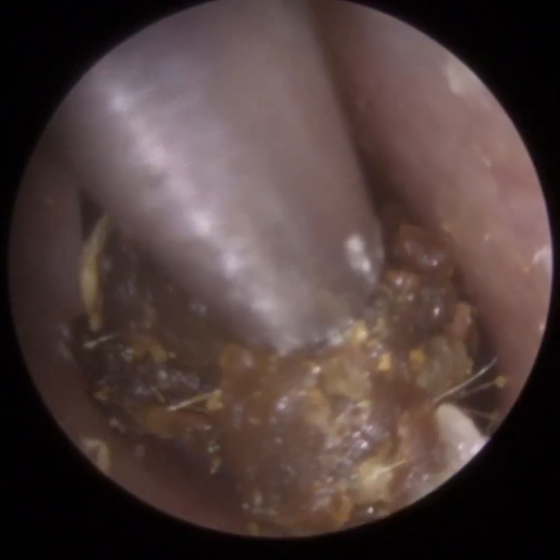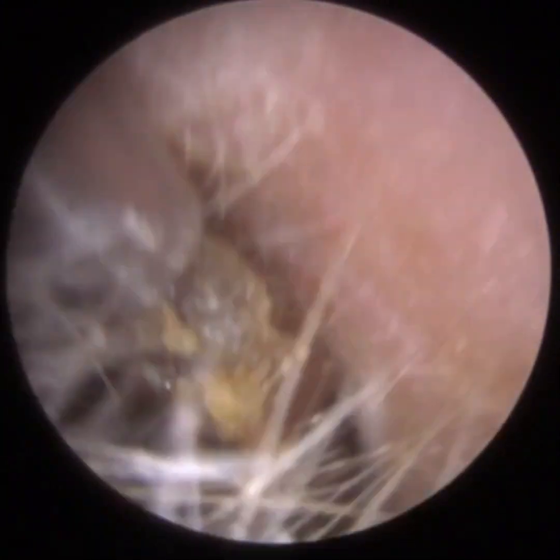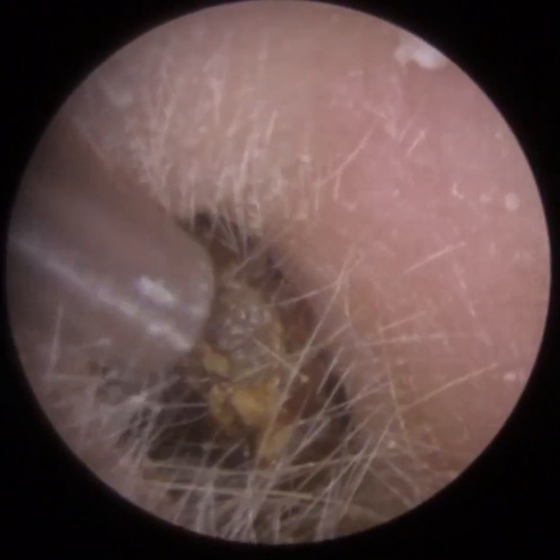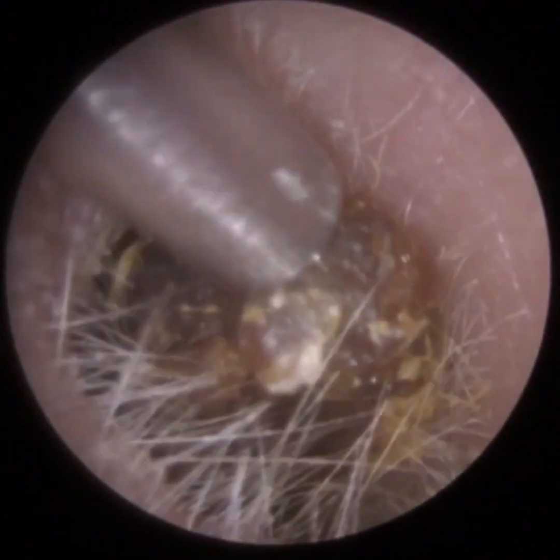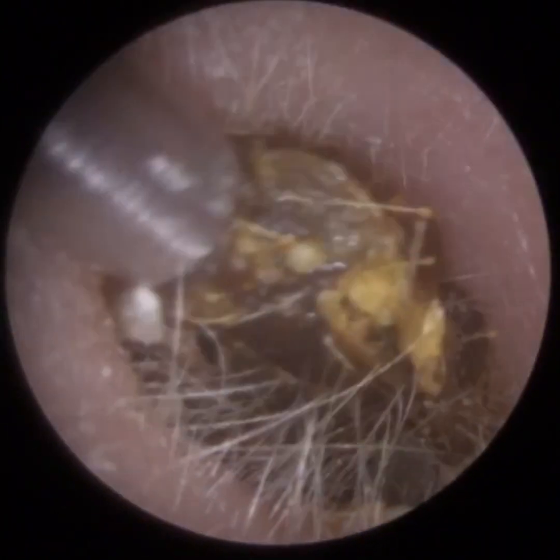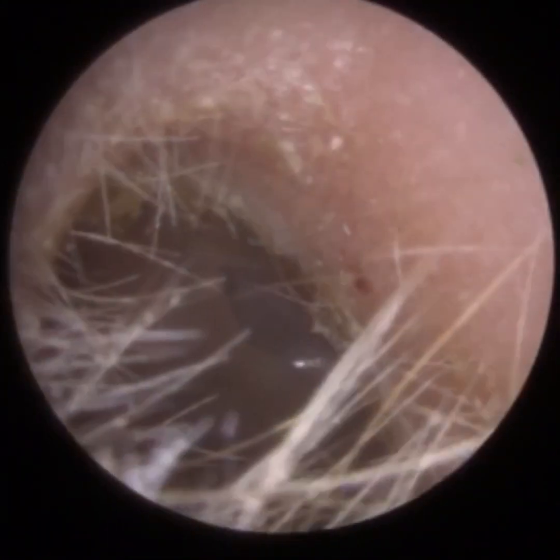Also, if someone's got a condition called otitis externa, which is an umbrella term for an infection or inflammation of the outer ear canal, it can range from severe swelling and infection to psoriasis or eczema of the ear — which is what this patient's got. They've got a bit of dry skin, a bit of itchiness, flaky skin. You can probably see that around the perimeter of the entrance of the ear canal. This dry skin amalgamates into earwax. So 60% of earwax is actually dead skin. In this patient, I would say it's a higher concentration — around 70% — and that makes the wax a bit dry.